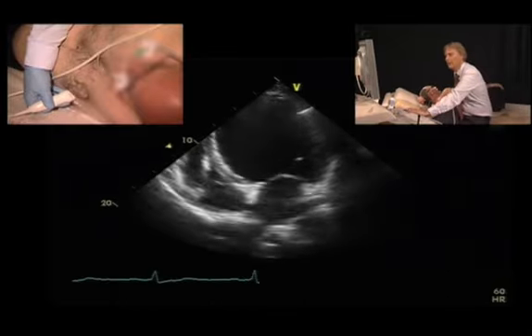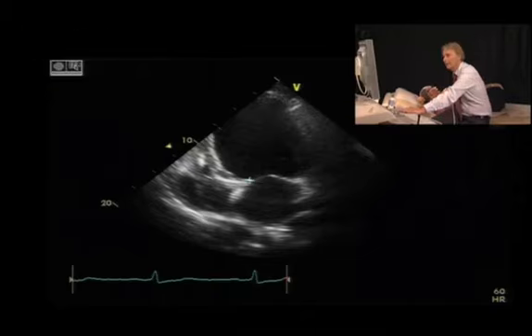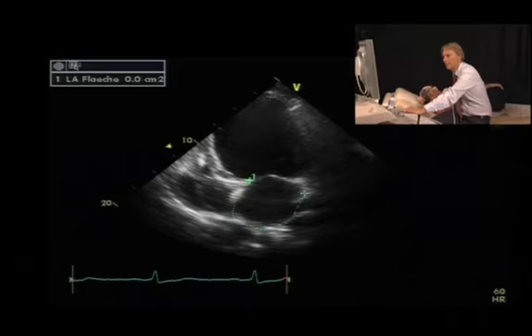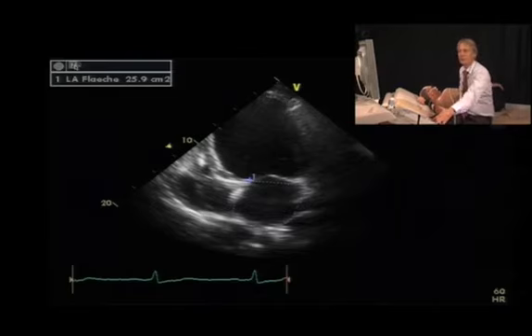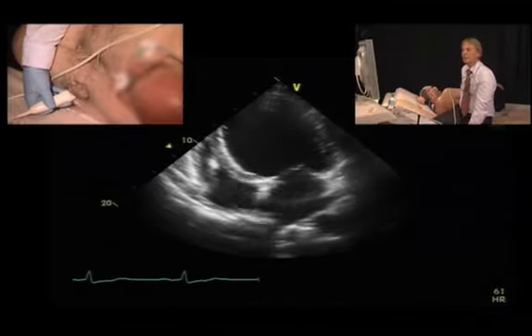To confirm this measurement, I would perform an area measurement of the left atrium. Okay, close the sector here. And we get 26 square centimeters, which just shows that the left atrium is not significantly enlarged and almost of normal size. Now, this is an important finding also in this setting because it does show that the patient is probably not at increased risk of developing atrial fibrillation, and that the patient has a good prognosis based on the size of the left atrium.